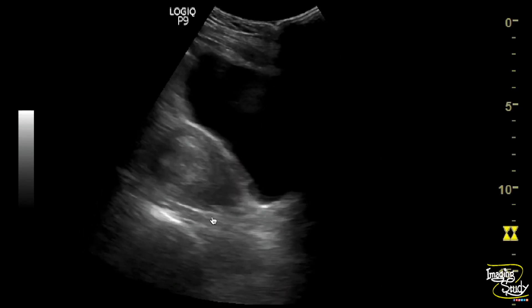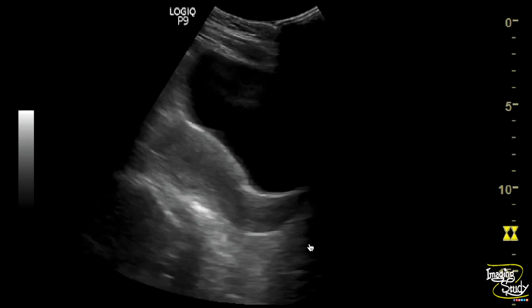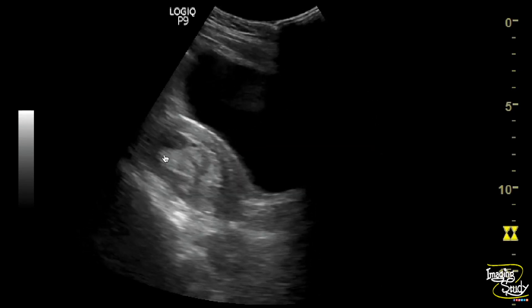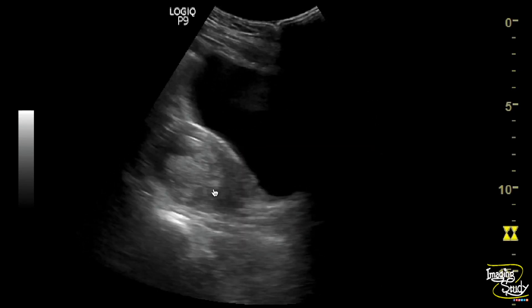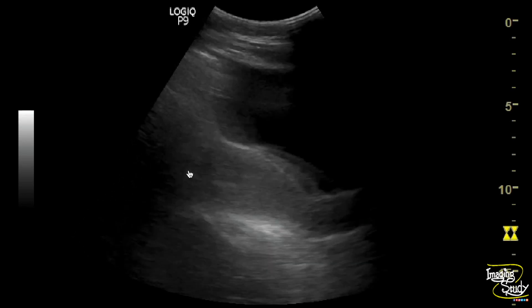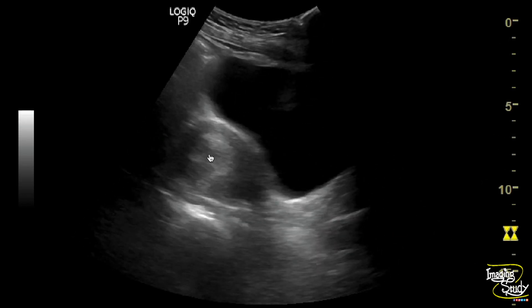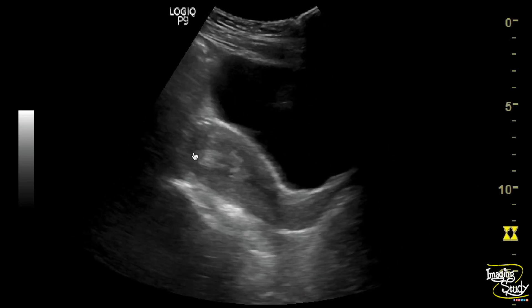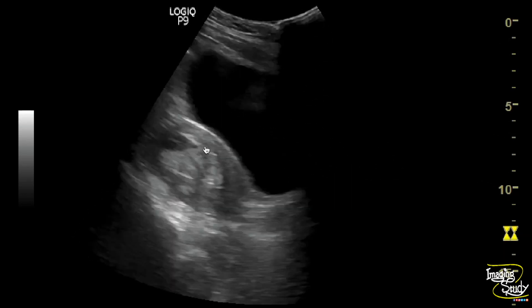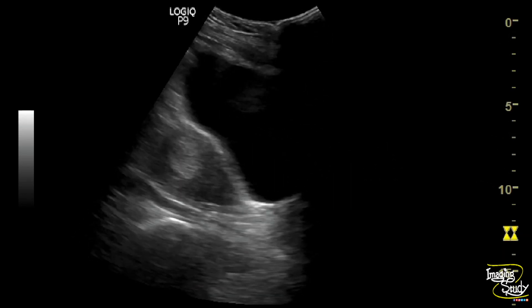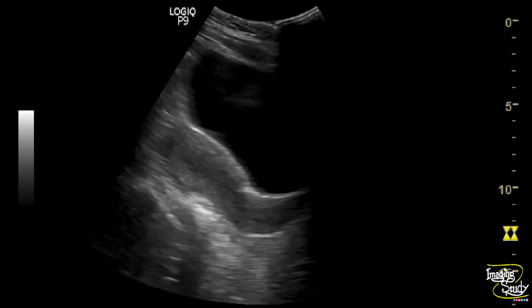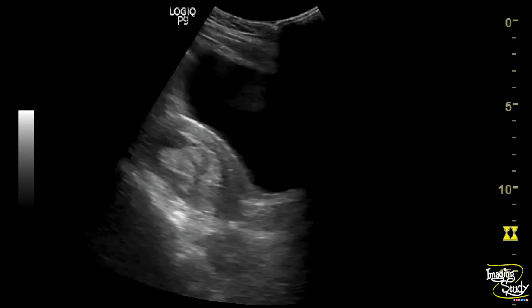Here's the longitudinal section of the uterus. You can see the thickened endometrium, and here you can see an anechoic area. This anechoic area resembles the pseudo gestational sac, which is common in ectopic pregnancy.